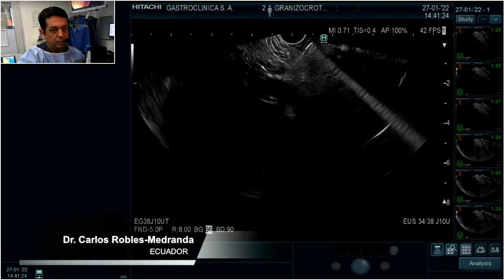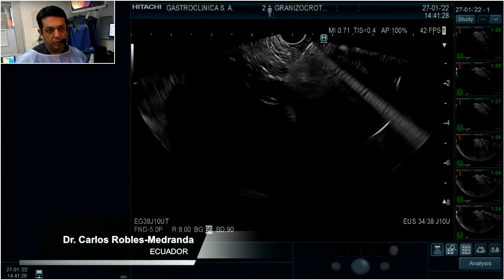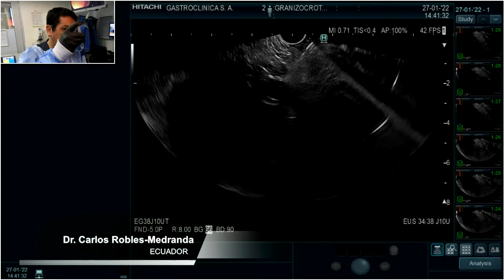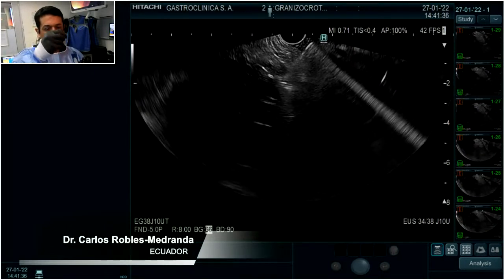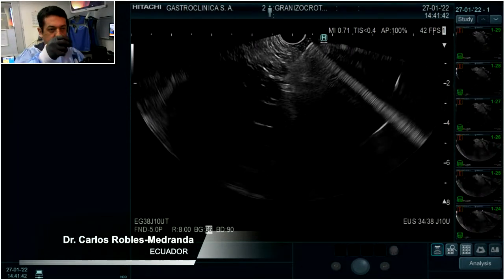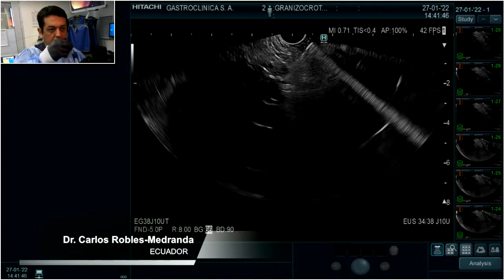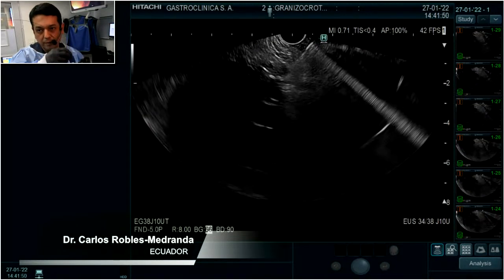So now, no, necesito la guía. I will flush with saline solution, it's okay. It's going down. And I will pass the guide wire at 0.035.